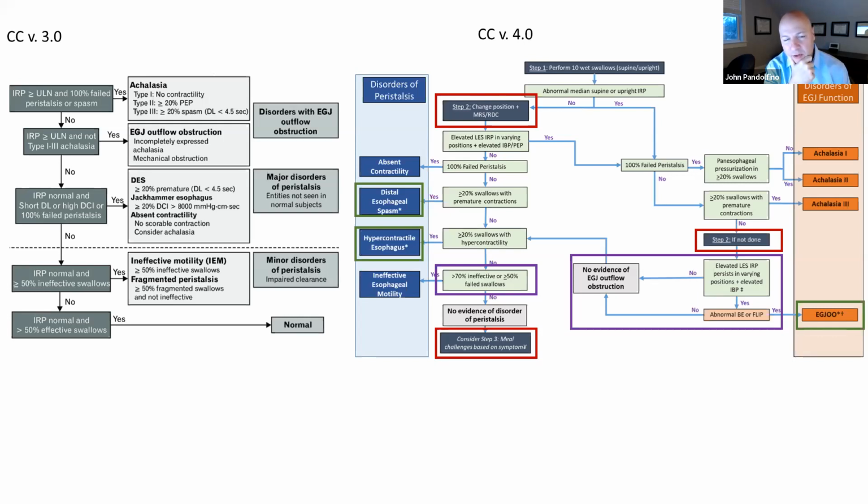And we felt that, given the amount of interest in this area, we sought to really introduce this back into the context of this. And to be honest, I really do think that small hernias in EGJ anatomy are extremely important in dysphagia. So we felt it would be important to give people better guidance. There had been mention of EGJ morphology and these new metrics loosely around the Chicago classification. We just figured we would formalize this, realizing that this was also an area that needed a lot more work.